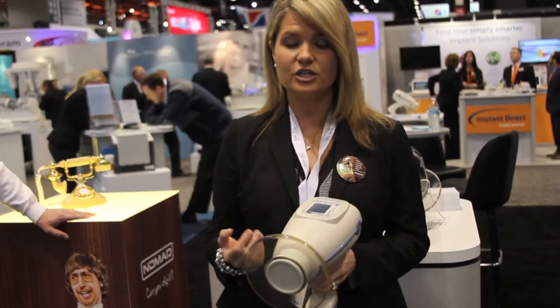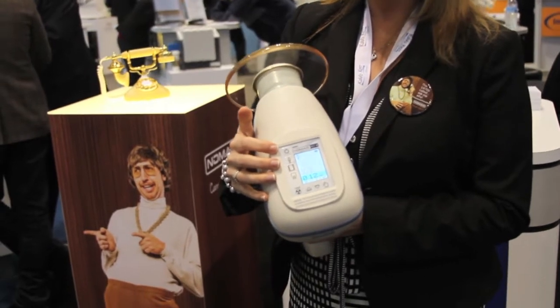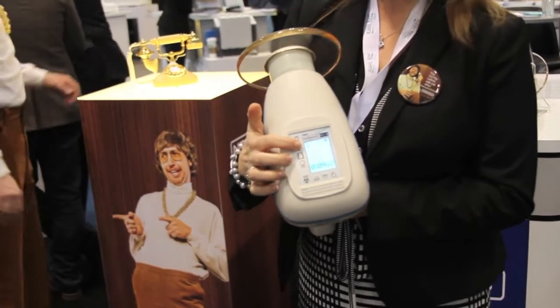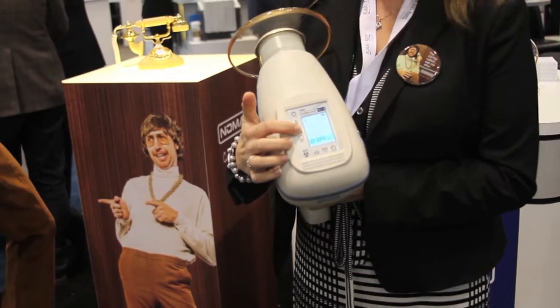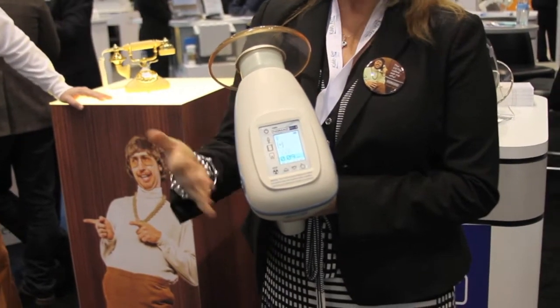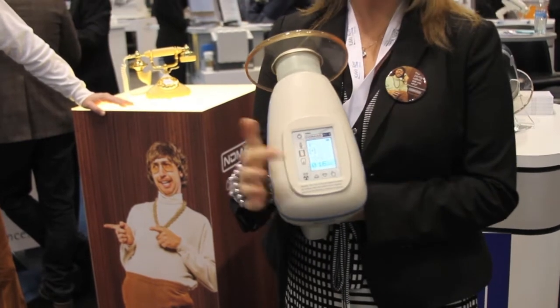It's extremely easy to use. If you look here on the pad — the touch screen — you just turn the unit on. You pick what patient size you want. You pick what medium you're going to use: are you using a digital sensor, film, or a phosphor plate? And then what are you shooting — anteriors, posteriors, or bitewings?